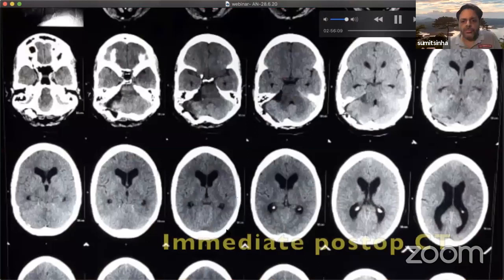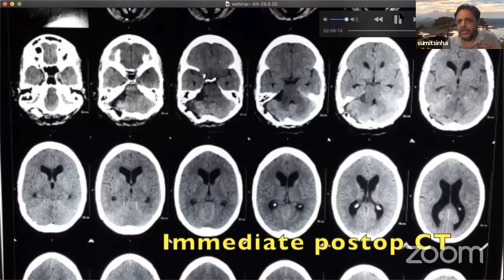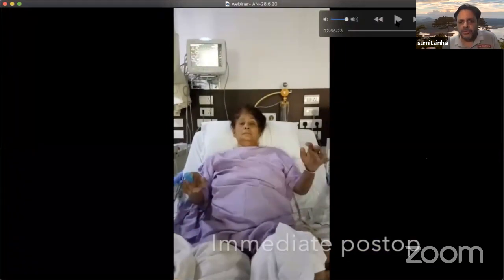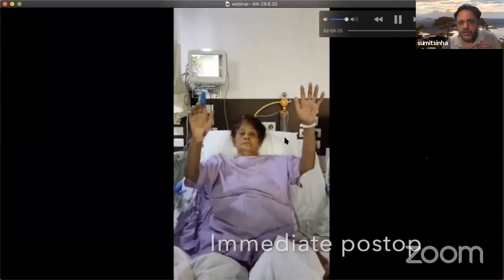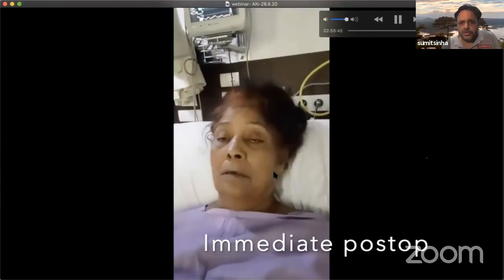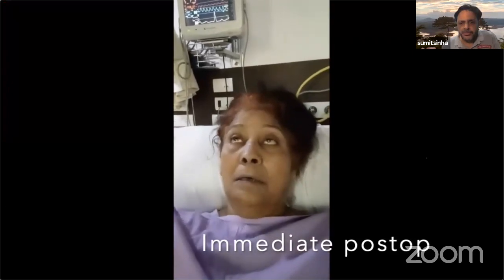This is the post-op CT scan of this patient. And this is the first night CT scan of the patient, in which you see the complete tumor removal. And of course, the patient was completely intact immediately after the surgery. This is the immediate post-operative clinical profile of the patient just after coming from the operation theater. And you see she has no neurological deficit, and the facial nerve also is completely intact. And this is immediately after the surgery.